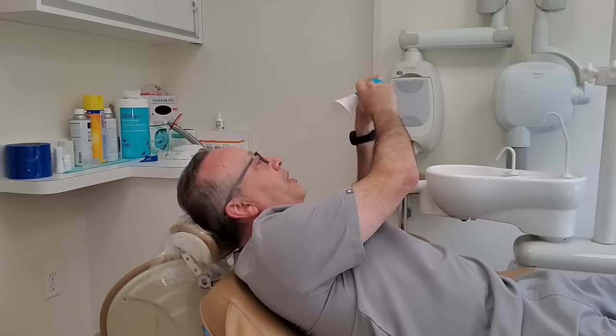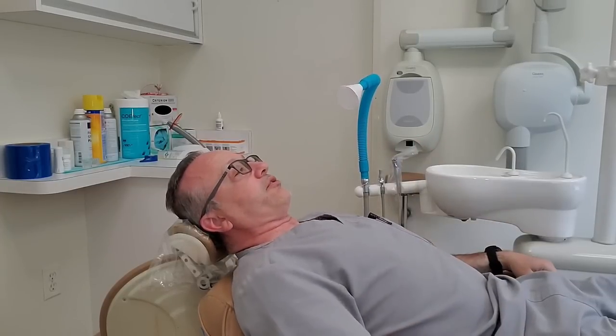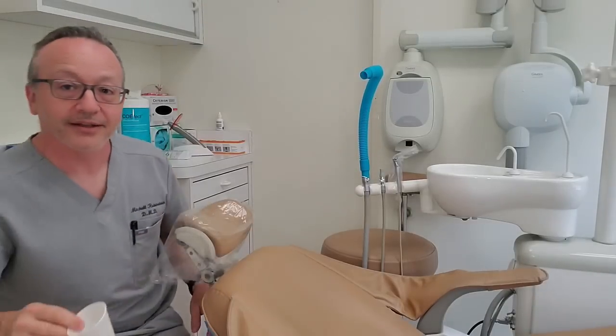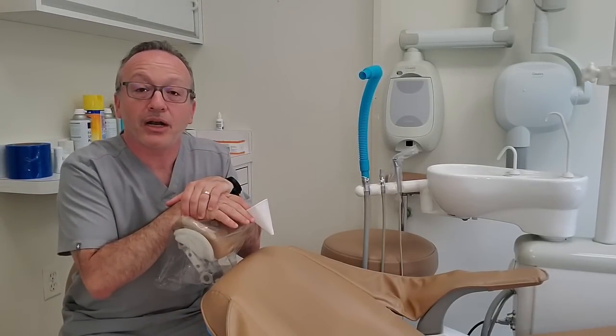I'll be the patient because, of course, I don't have a patient here right now. This gets bent to whatever angle you want. They say it should be within 10 inches, but even from here I can feel it moving air. You do your procedure. This is not a substitute for a really high volume unit, but if you have somebody who's working in a room where there is only one operator and a high volume suction that's not being used, I would say this is better than nothing and it costs less than a buck per patient.